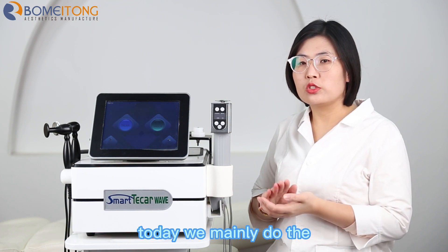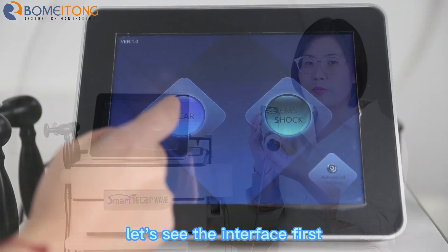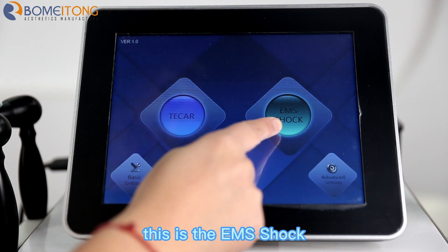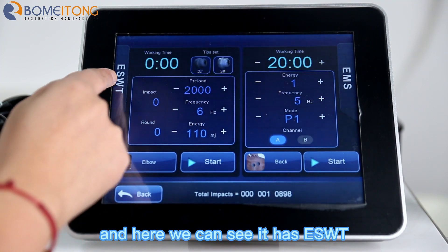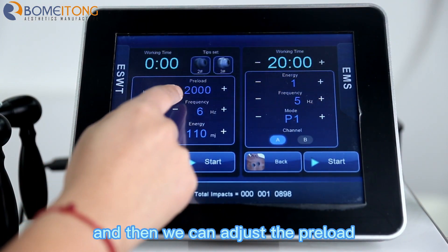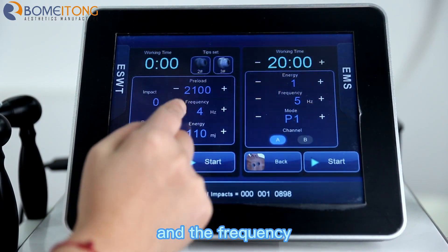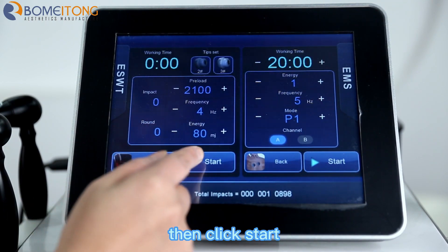Today we mainly do the shockwave treatment with this handle. Let's see the interface first. This is the EMS shock, and here we can see it has ESWT. We can adjust the preload, the frequency, and also the energy. Then click start.